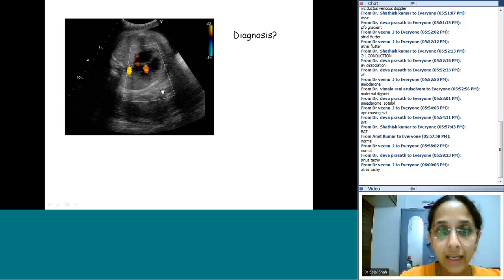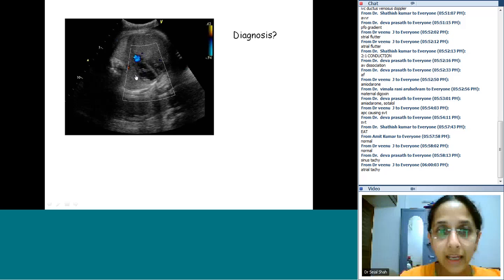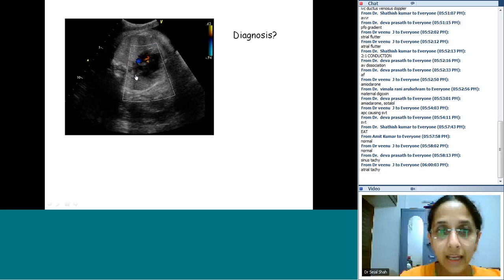You can see, pay attention to the ventricular contractions. Any answers? The ventricles are not contracting normally.